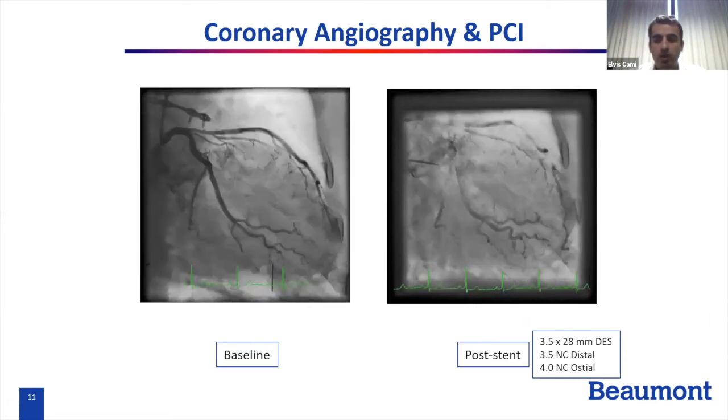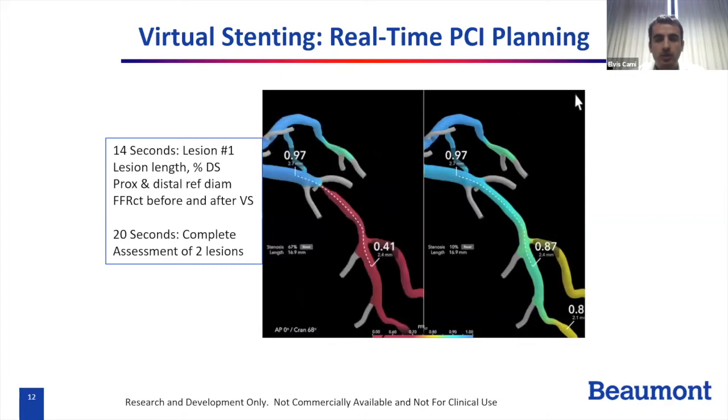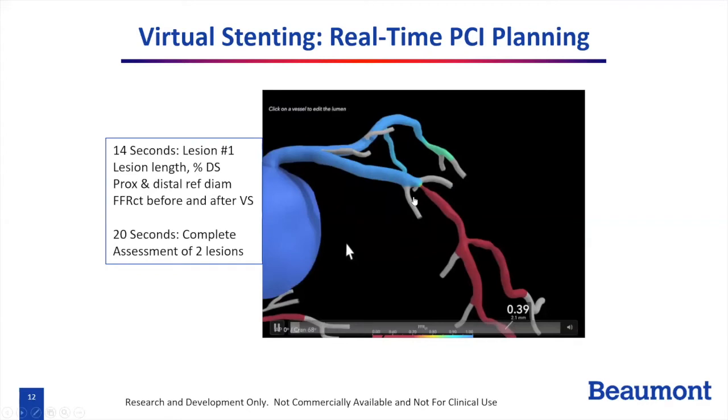So now HeartFlow has a product which we are using, but it's not commercially available everywhere yet. And you can have this on your iPad, iPhone. You can go online. You can kind of click, as I'm doing here, on the vessel, on the LAD, and it will tell you what the diameter is where you're clicking.